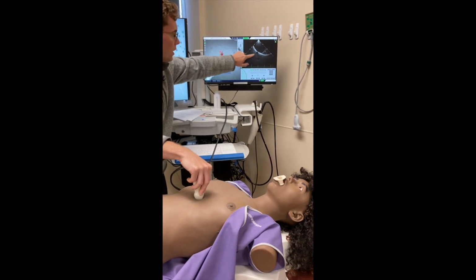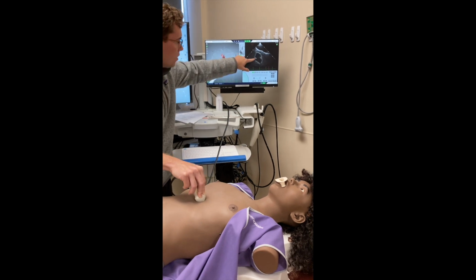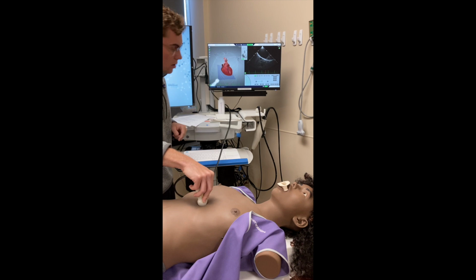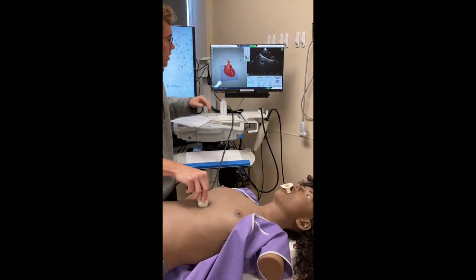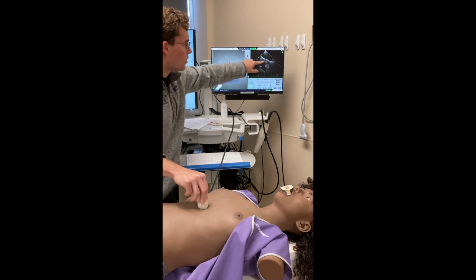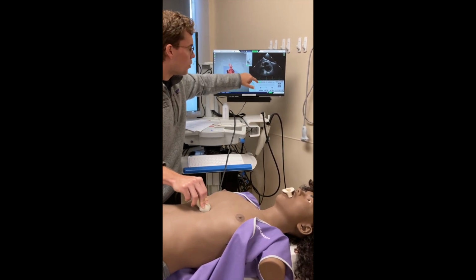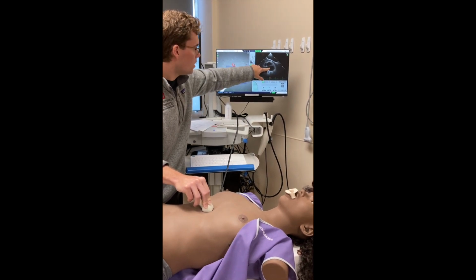So you have your liver, and then your IVC, and then follow your IVC up until it drains right into the right atrium. We like to think of our heart as right and left sides, but essentially it's more anterior-posterior, your anterior being your right side. It's always going to be in your near field. So you have your right atrium, right ventricle. And then posterior is going to be your left side of your heart, far field, left atrium, left ventricle.